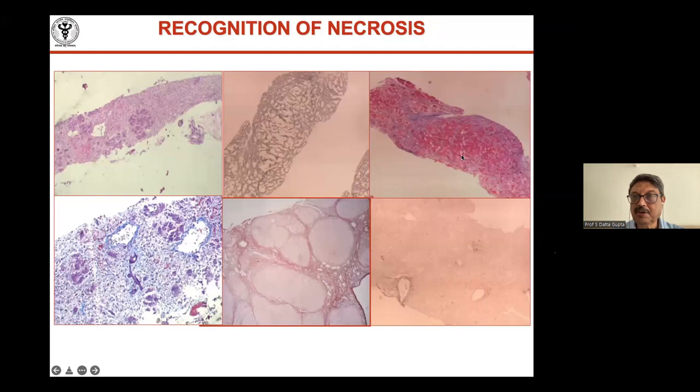And in fact, in subacute hepatic failure, you get a spleen that is palpable, some little ascites, pedal edema, and a liver that is a little small, although it may not look nodular, it may look nodular in some ultrasound. And if you do a liver biopsy with Masson's trichrome, it's not actually the deep blue color of this. You may mistake it for cirrhosis. So these stains are not that helpful.